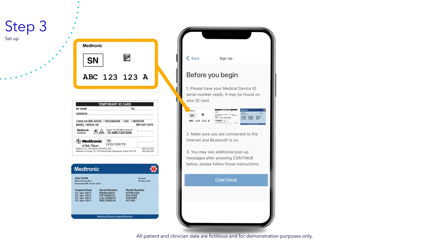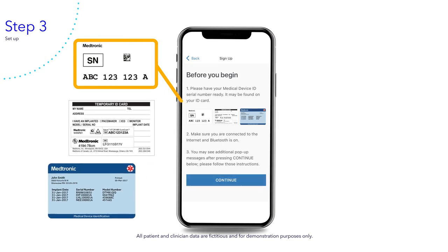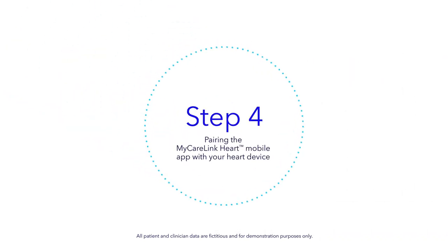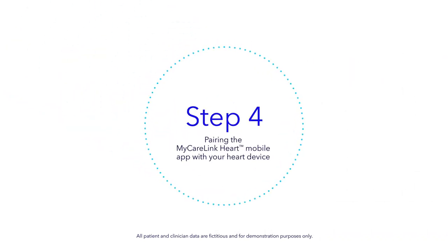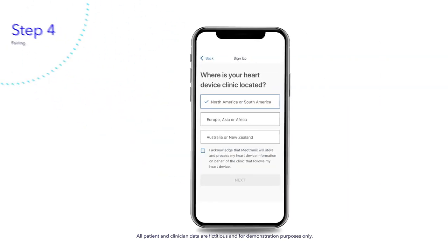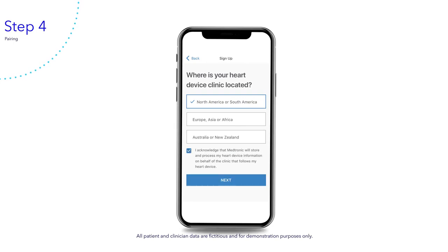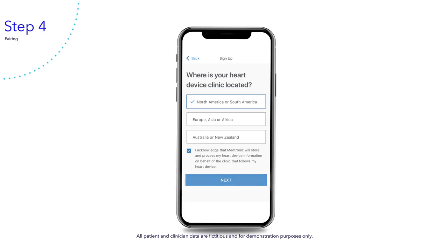Tap continue. Choose where your heart device clinic is located, then tap the box to acknowledge that Medtronic will store and process your heart device information on behalf of your clinic. Now tap next.